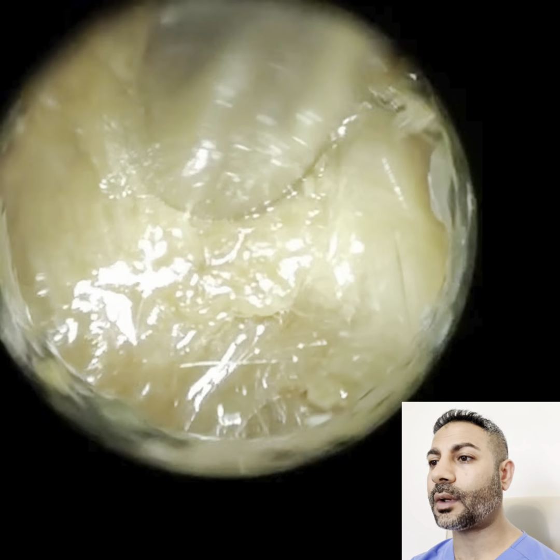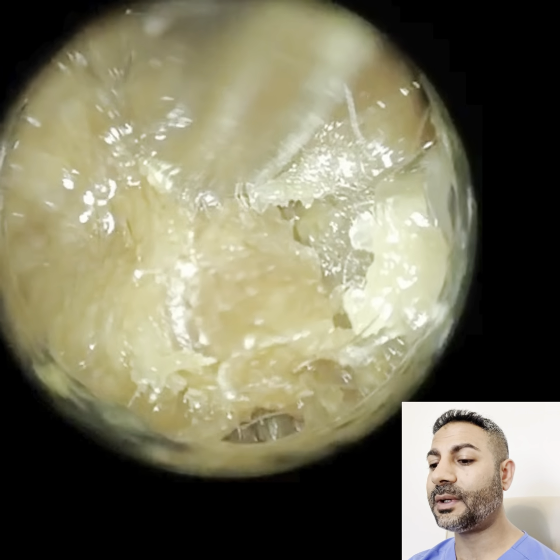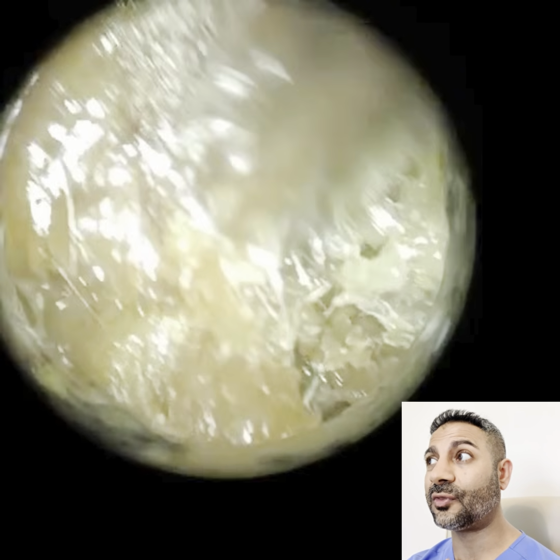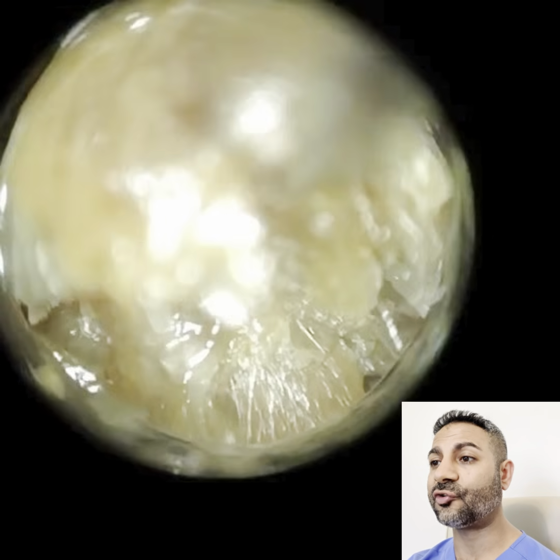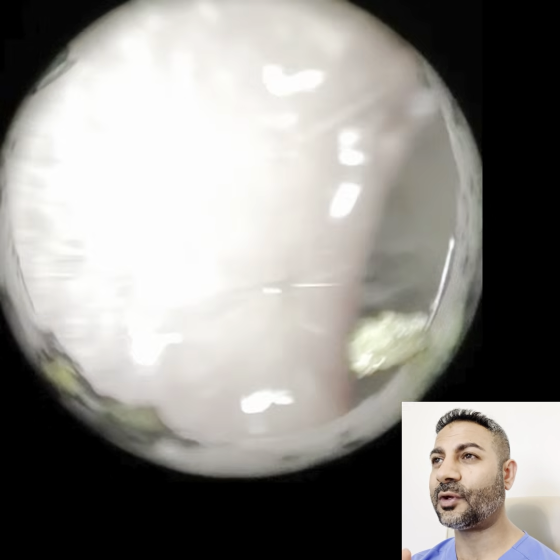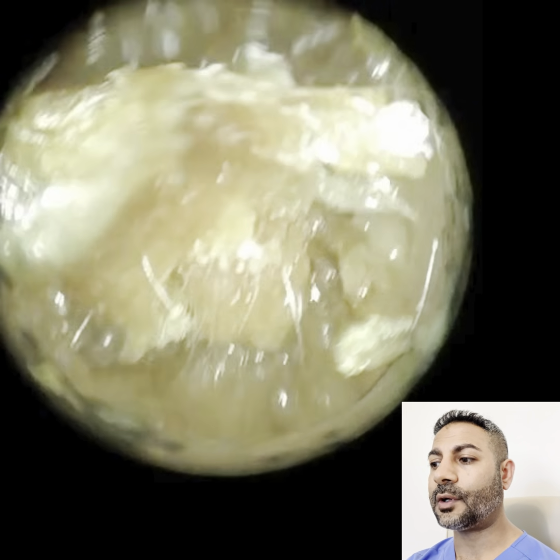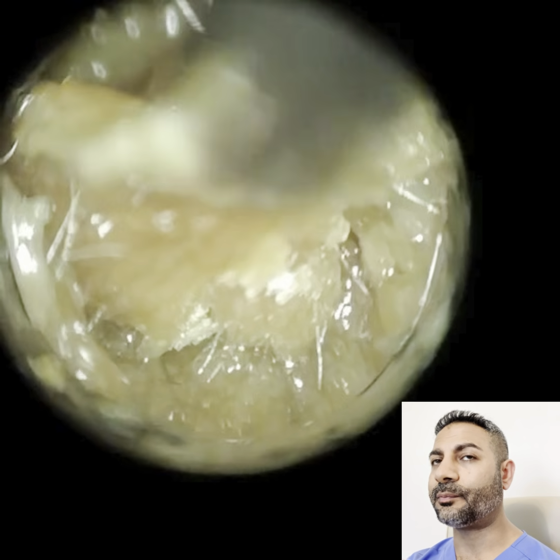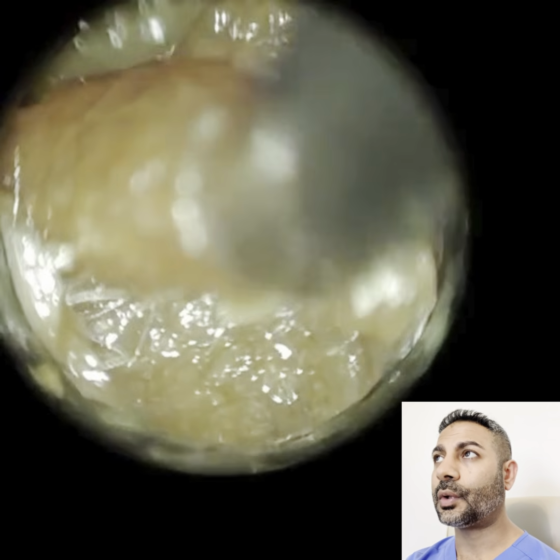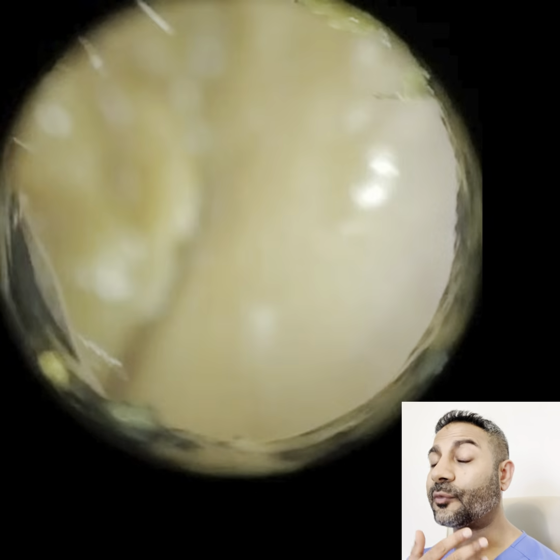So I'll just explain a bit more about tympanometry. We measure middle ear admittance, so how much sound is admitted through the eardrum and through the middle ear, the ossicular chain, the three bones, by actually measuring the middle ear impedance. So we're doing a reverse measurement. We've got a probe that we put in the ear. It's got multiple probes, three in total. One changes the pressure, the other one plays a tone, and the other one's a microphone.